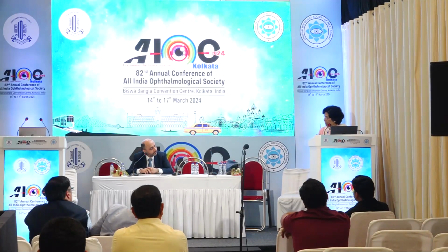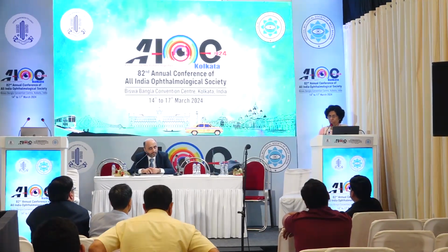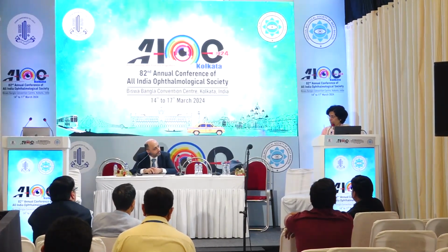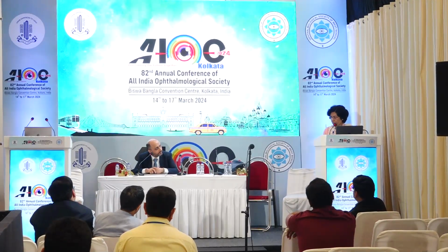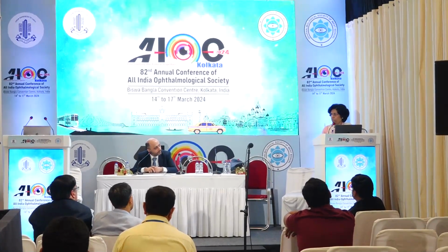Cataract is not much. You are still able to visualize the retina. You think you will be able to do the surgery. Then in these situations, I do not do a combined surgery. I do not do a phaco, because a combined surgery always creates more inflammation and higher chances of all problems. Like I said, even NVG and all can develop. So in this situation, I first do the retina surgery, settle the retina, and at the time of the silicone oil removal, then I'll plan for the phacoemulsification. But if the posterior disease is less, that means the fibrovascular proliferation is small, the amount of RD is small, then I do a combined surgery.